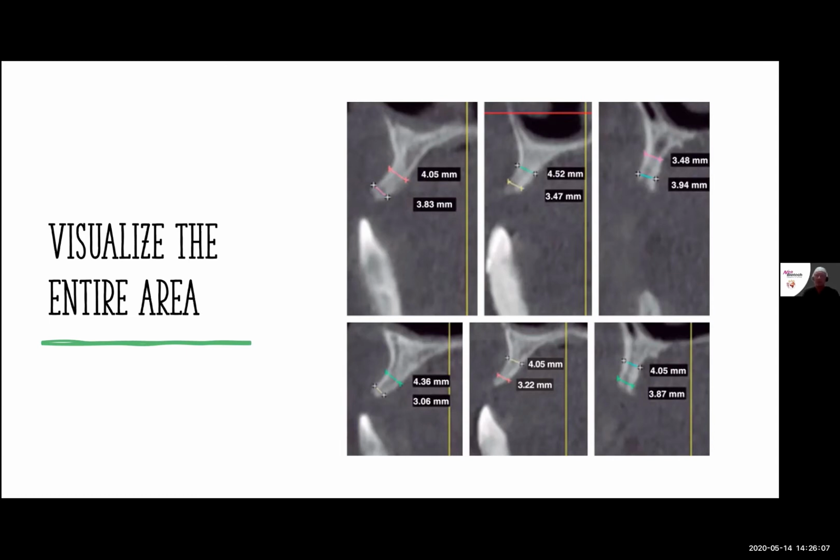And so you need to know the areas where the medullary bone is. You need to know the thickness of the cortical plate that's here. Is it all even? Are you about 1 millimeter or less of cortical plate? Are there areas that it's 2 to 3 millimeters of thickness with that? You need to know that for the area of the graft recipient site.